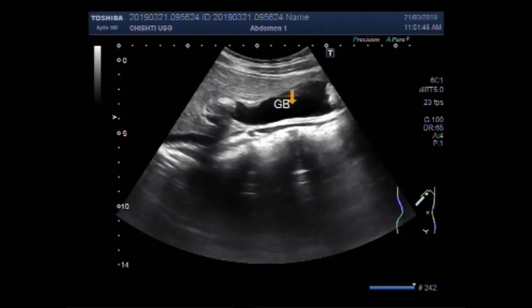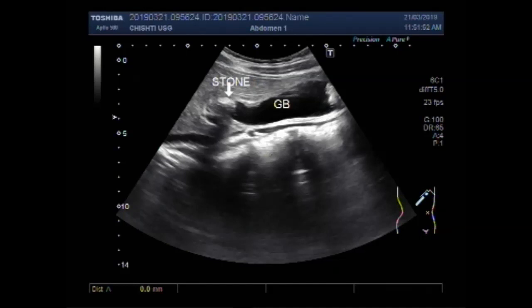This is the gallbladder. This one is a stone, and this stone is impacted in the neck of the gallbladder.